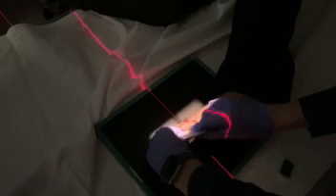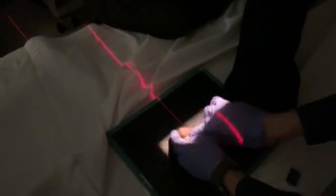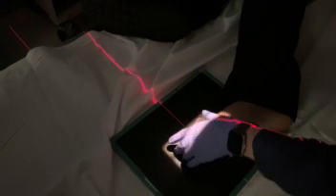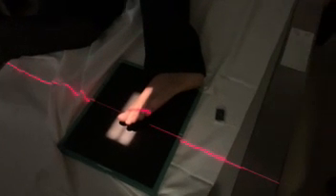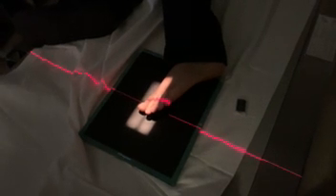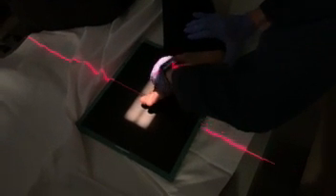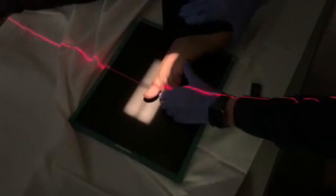If it's the third one, right, you could put it like this. If it's the first one, if you're not confident they can still hold these, you can put it like this. Right? But the whole idea is just to get this toe out of the way so that you can clearly center on either that IP or that PIP joint. And our goal is to try and get that toe nice and lateral.